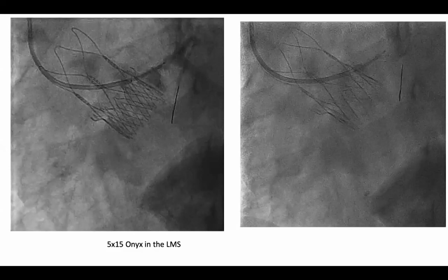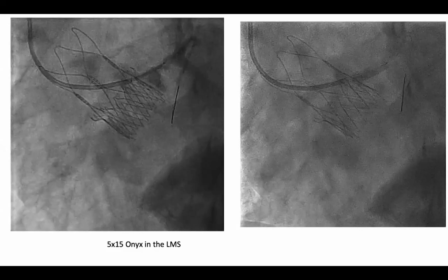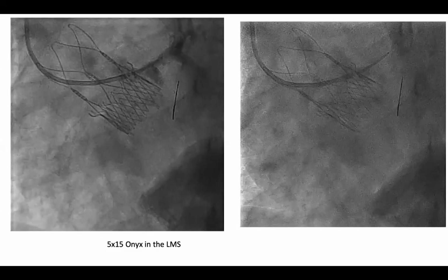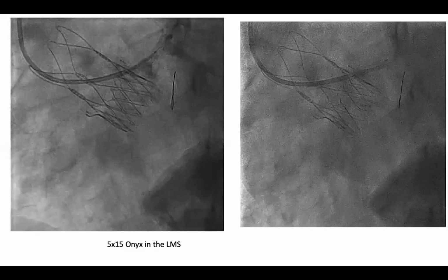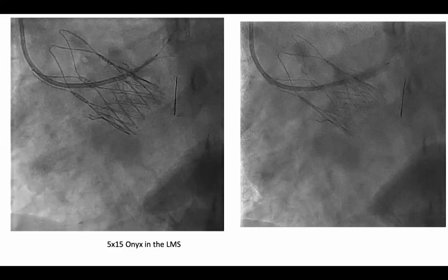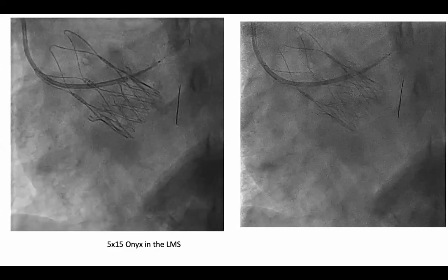What I would think in this sort of case is the ostium of the left main, or maybe the proximal LAD just after the post-stenotic dilatation, and the left main will be roughly similar or slightly bigger than that, rather than measuring the size of the left main in the post-stenotic dilatation segment.